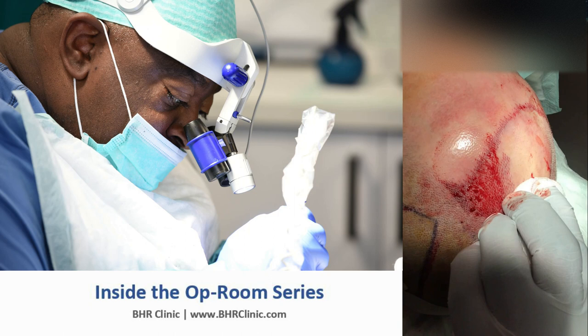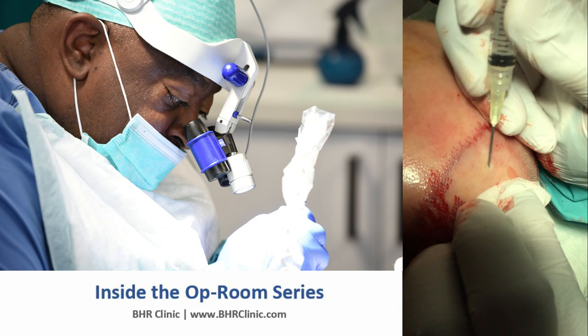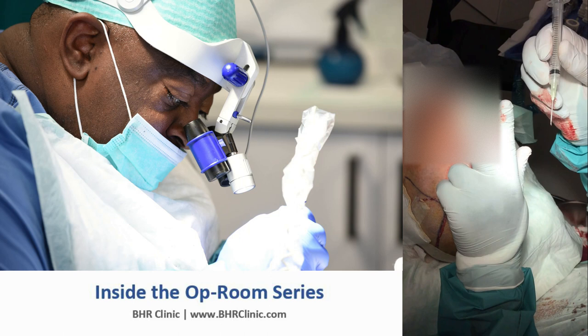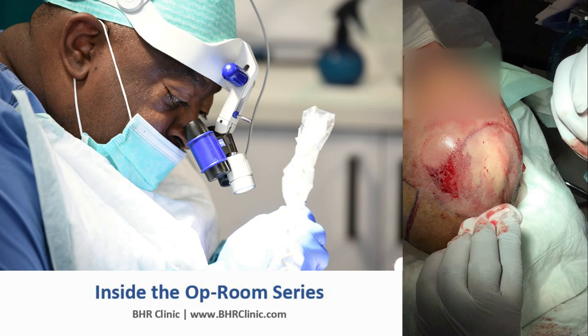As you can see, I'm making one incision like this, another one like that, and one in the middle — so basically one incision, another one, and another incision in the middle to block the light. This is how you make incisions in order to give the best illusion of coverage.